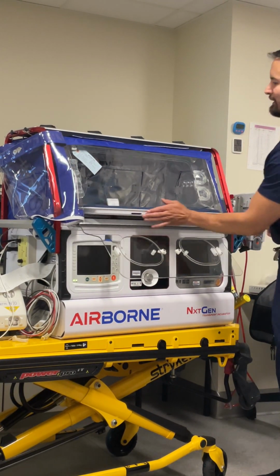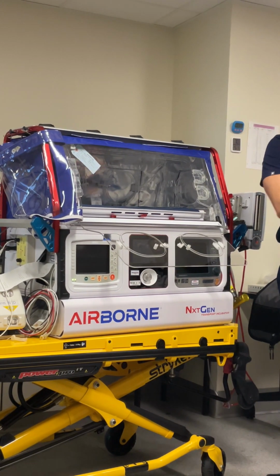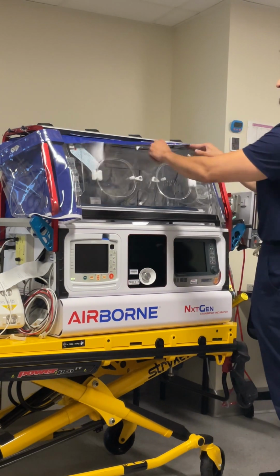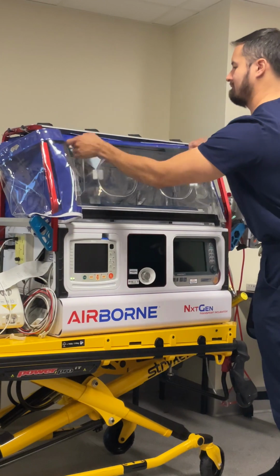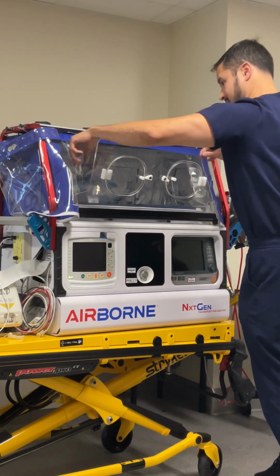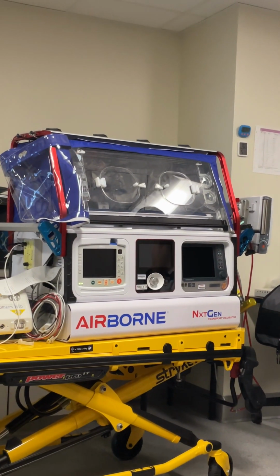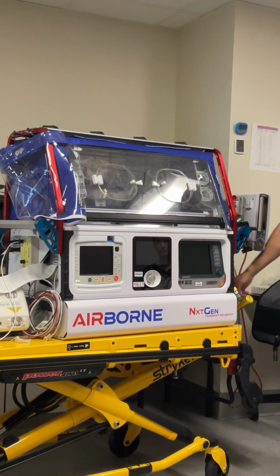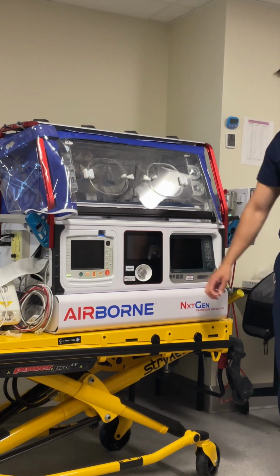So we'll talk about removing the tray when we talk about cleaning it, but you can actually pull the whole tray out if you want to. Okay, so tanks are all under here. Tanks are off to the side here. These are the new regulators. They're a little smaller than what you had.